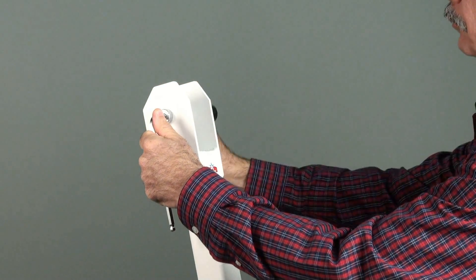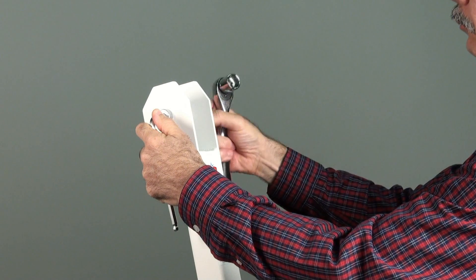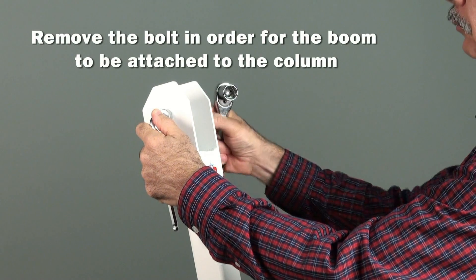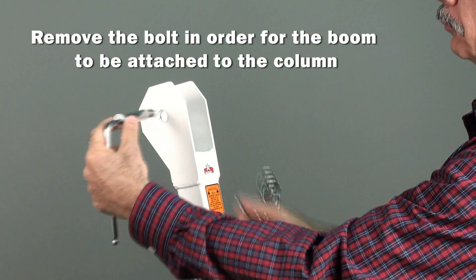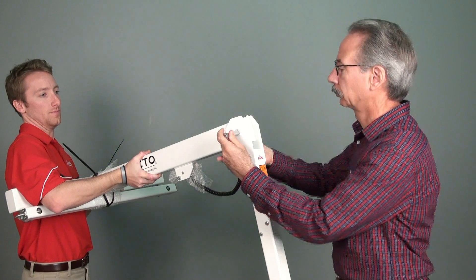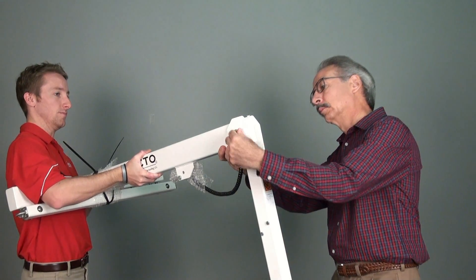Now we will attach the boom assembly to the top of the column assembly. First, remove the bolt so that the boom assembly may be attached between the mounting plates of the column assembly. With assistance, insert the boom assembly between the mounting plates of the column assembly and replace the bolt.